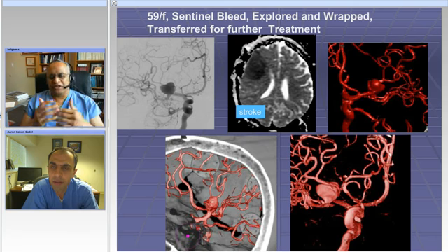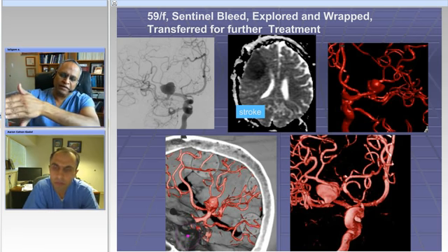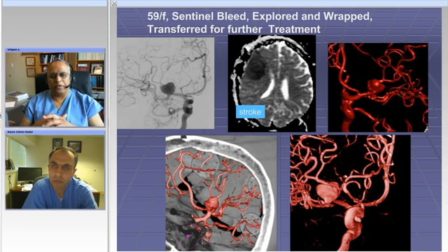Of course, the nurses count them, you know, and it's a very nice way to avoid the clip from catching the perforators, because you sort of dissect the perforators, you just put the rubber dam there, and then you slide the clip between the aneurysm wall and the rubber dam so the perforators won't be caught.